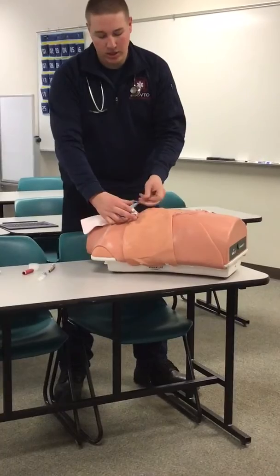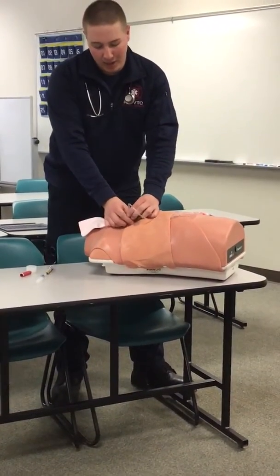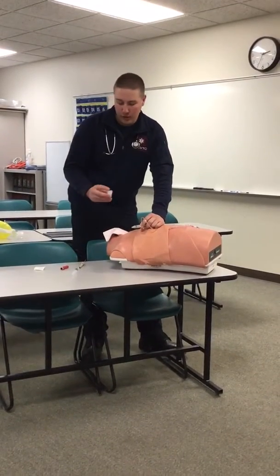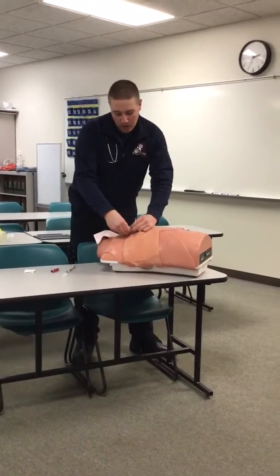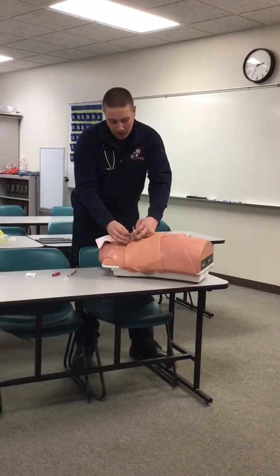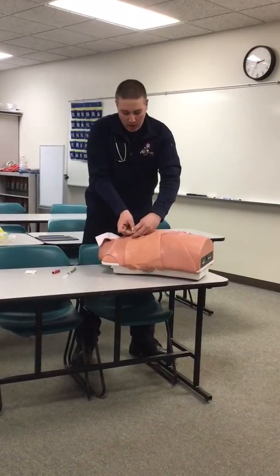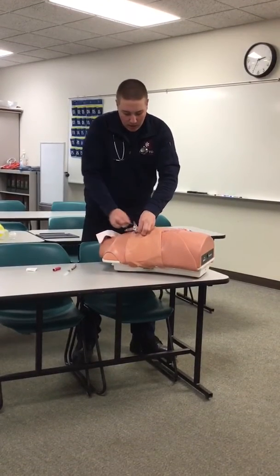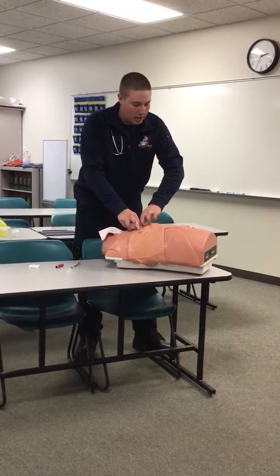And then to secure it, you would have 4x4s, and you would kind of stack them on each side. We don't have 4x4s in here. And then once you have your 4x4s there, you would grab your tape, and then you would tape those 4x4s down, secure it. Then on the next side, tape it down, secure it, and then just to secure this, you would tape this down as well to secure that.